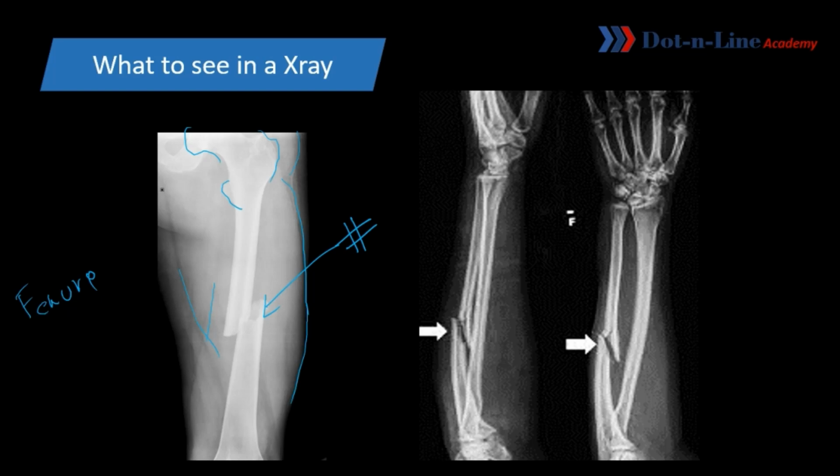Any other defect? Generally, if we see, there is no other defect. What else we see here is this. This is not a defect. The structure we see here is the pubis.